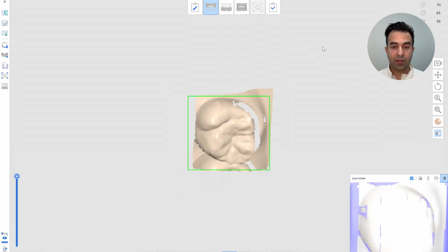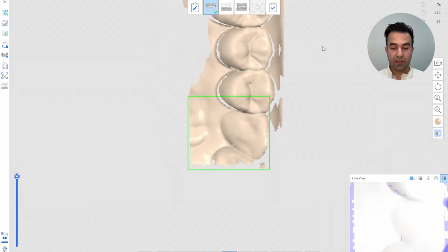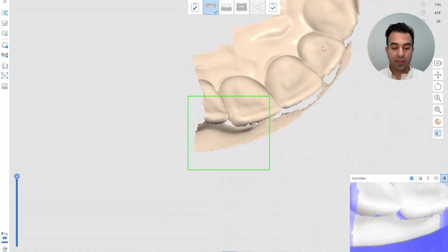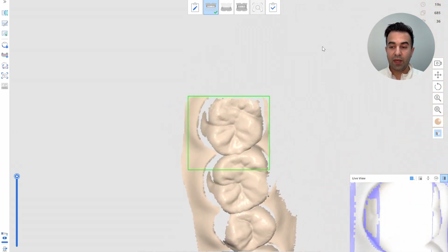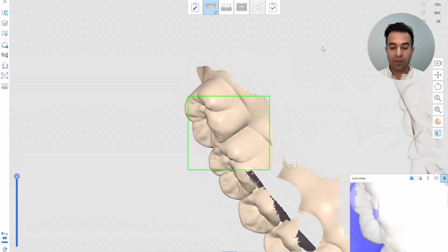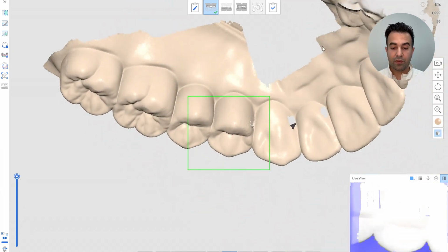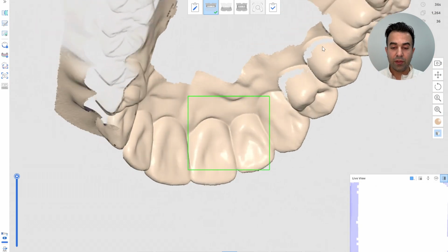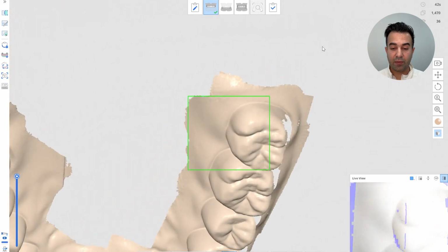We have only the upper arch to scan. Select the upper arch, follow a scanning strategy. In this case, I'm demonstrating real speed. It's not edited. And you can see on the top right-hand side, we have 36 frames per second, as that's the maximum speed you can get from the i600. The laptop that I'm using is a Microsoft Studio. It comes with high specs, and you'll see it will save quite a bit of time in the post-processing as well.